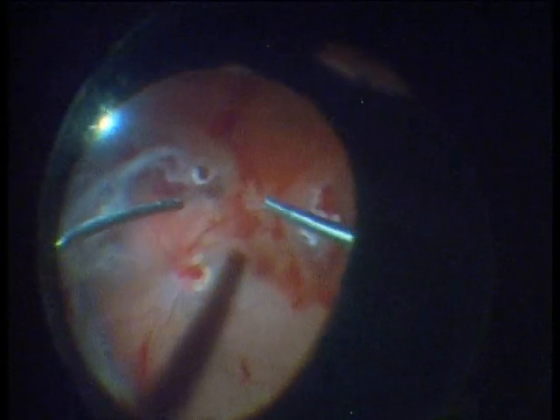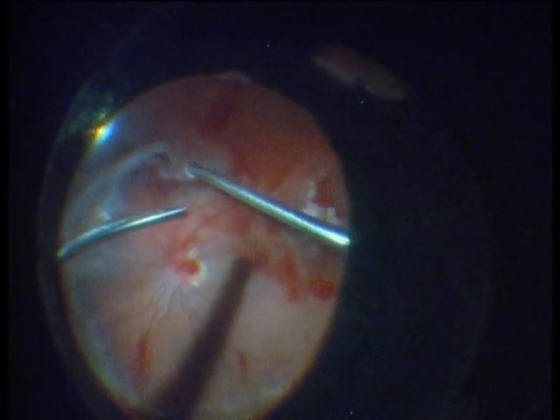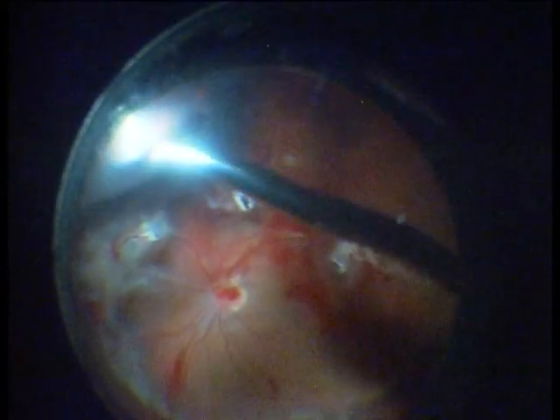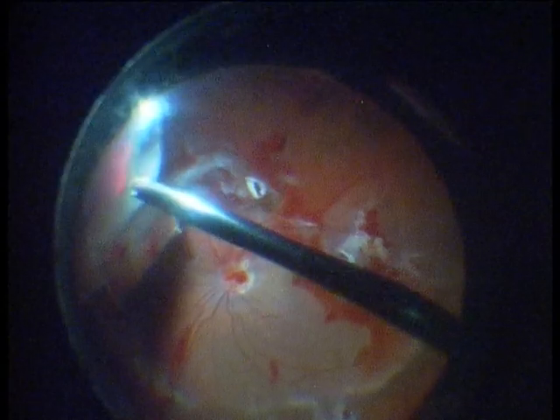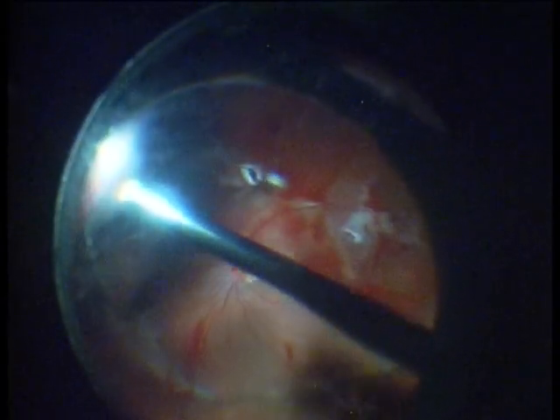You can see that there is a rupture below the optic disc at 6 o'clock, and I think also at 5:30. First we have to trim the vitreous base by indenting the sclera with the scleral depressor and cutting the vitreous base with the cutter.